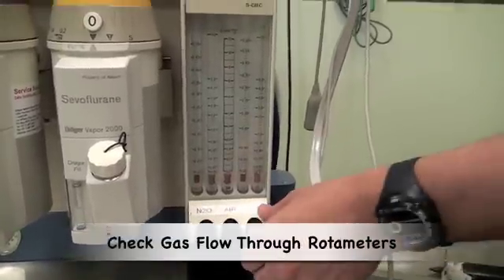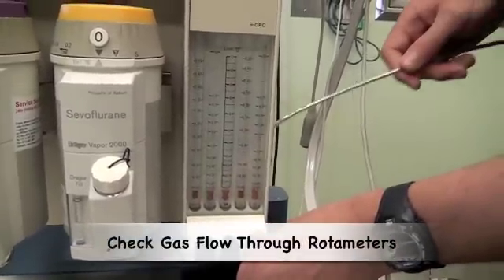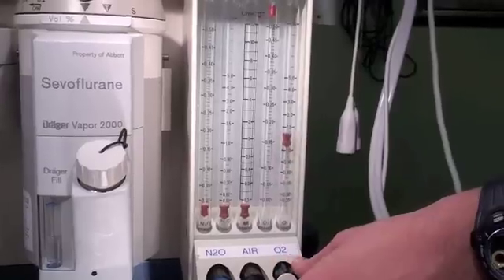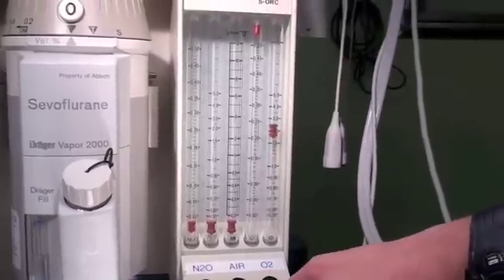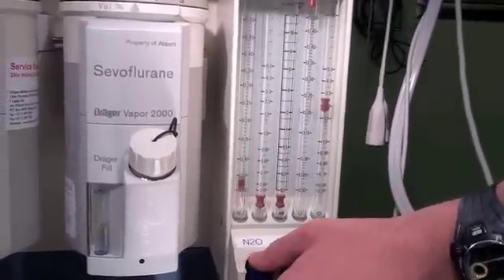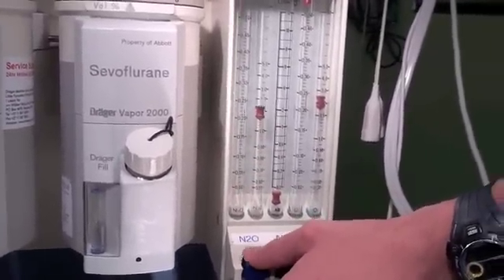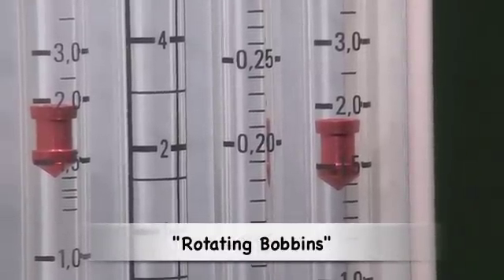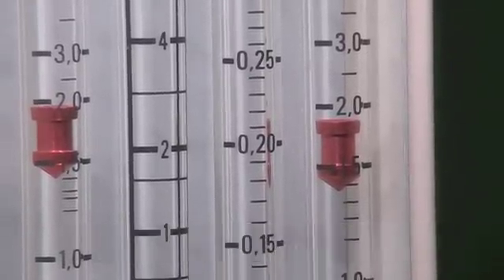One then checks the flow of each gas through the variable orifice rotameter — oxygen, medical air, and nitrous oxide. The bobbins rotate so that one can see that gas is flowing and that the bobbins are not just stuck.